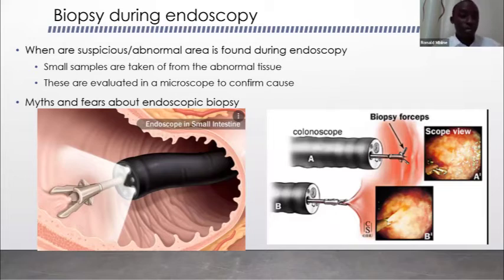I think maybe at some point at the end, members can raise some of the fears and myths about biopsy, but presently there is no evidence that taking biopsies makes any disease worse. Most of these myths have been there for years. And also the bites are really small. They cannot perforate through the intestine to go to the other bits outside the lumen of the intestine.